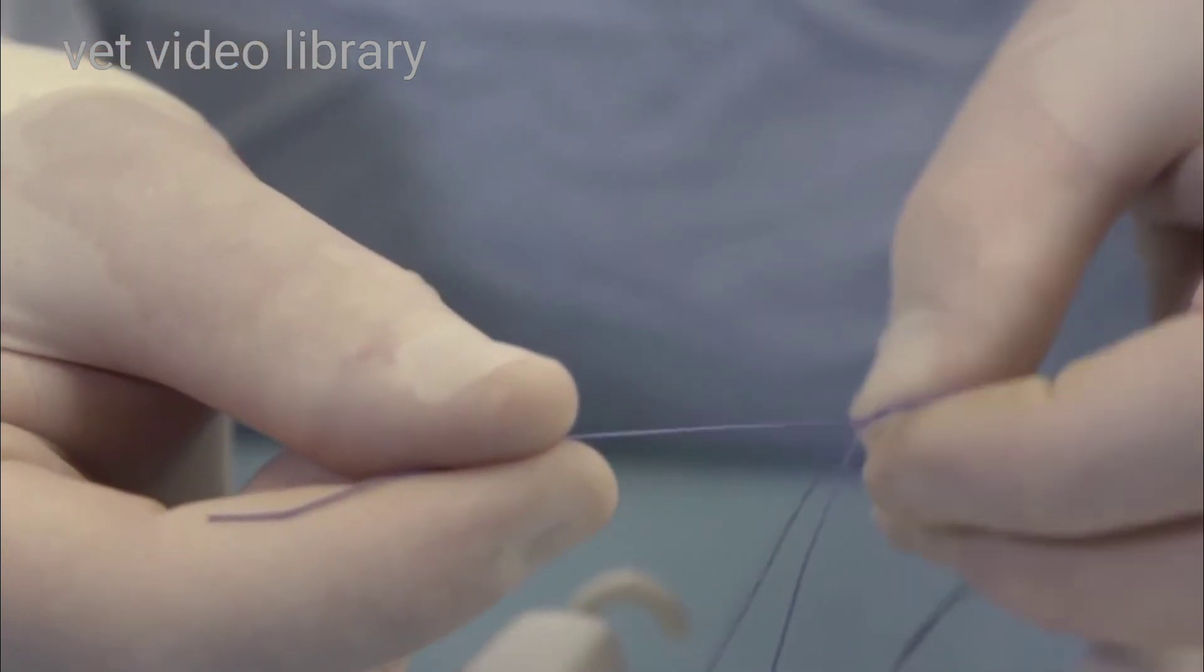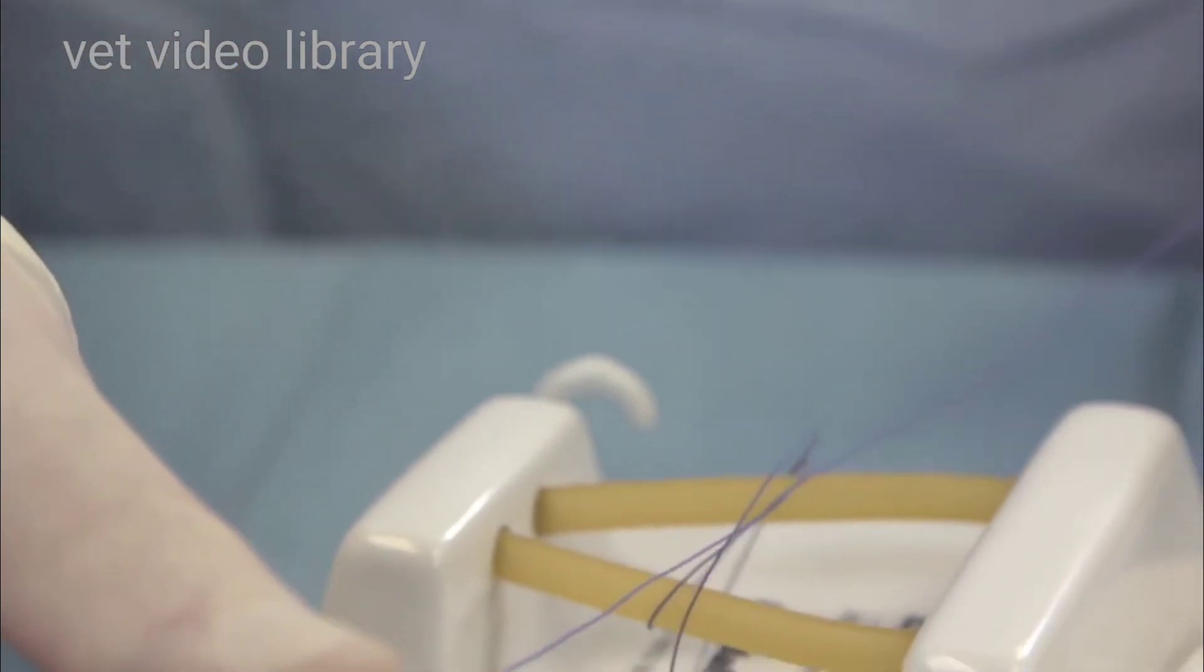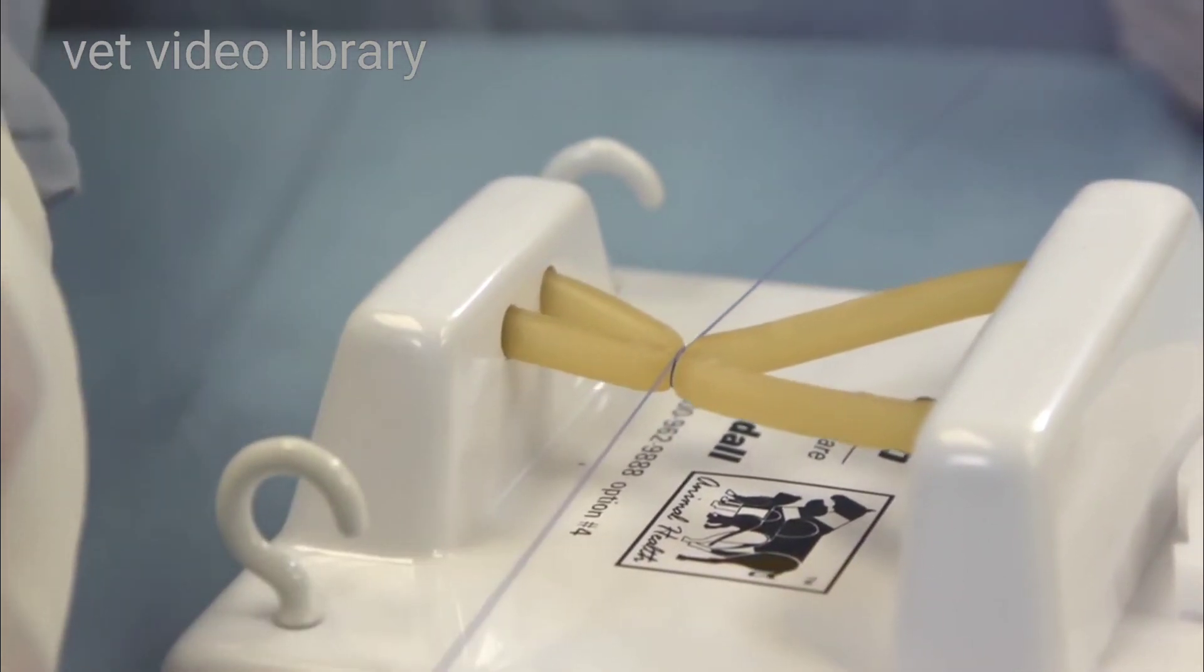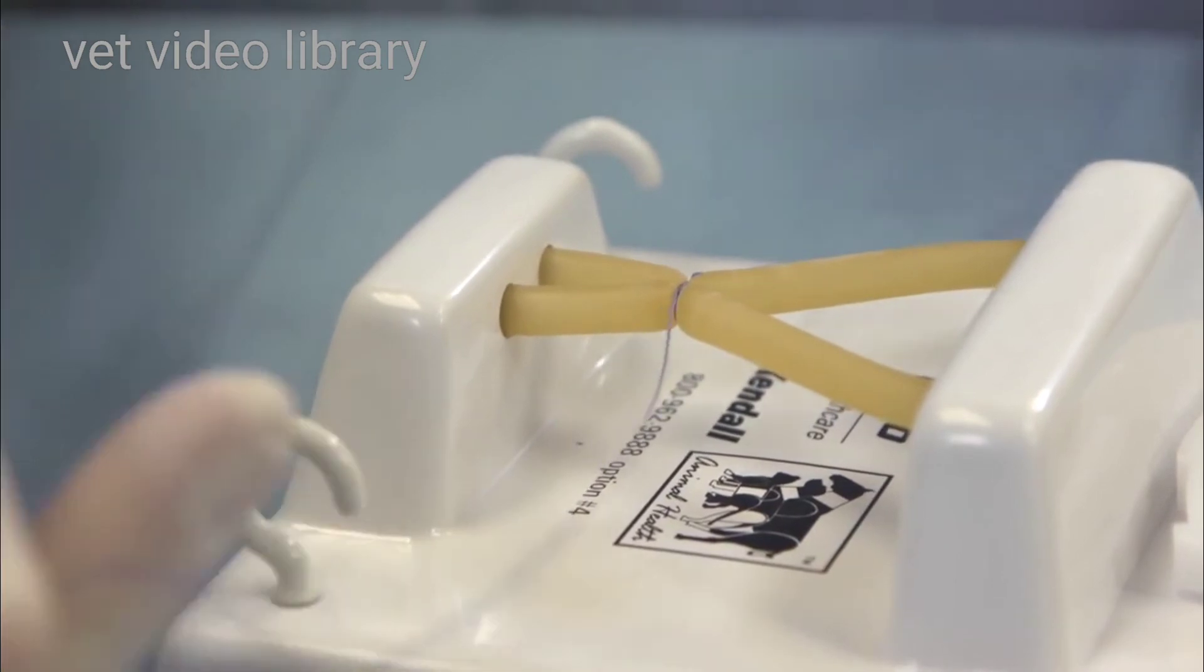And now I have the first part of my Miller's knot. I pull this down, I pull it tight, cinch it down, and it stays there.